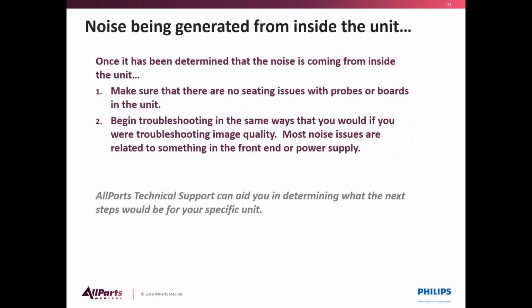If you end up in a situation where you find your noise is being generated from inside the unit, once it's been determined that the noise is coming from inside the unit, you want to make sure that there are no seating issues with the probes or any boards in the unit. In other words, make sure that they're seated properly. Sometimes reseating them helps.